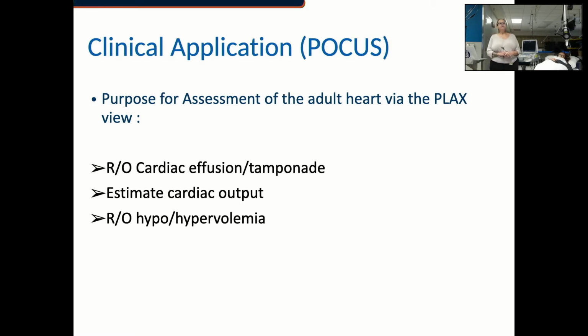This is a very good window for ruling out cardiac effusion and tamponade, for estimating visually the cardiac output and ejection fraction, and as a means of ruling out hypo or hypervolemia.